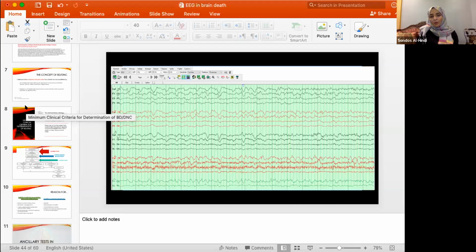Recovery from coma. So technically, when you have a clinical diagnosis, even if the EEG is not consistent with brain death, you need to rely on your clinical assessment. I've never seen any case report of a normal EEG, but you could have residual cerebral activity from other abnormalities, other deep, poor prognostic comas.